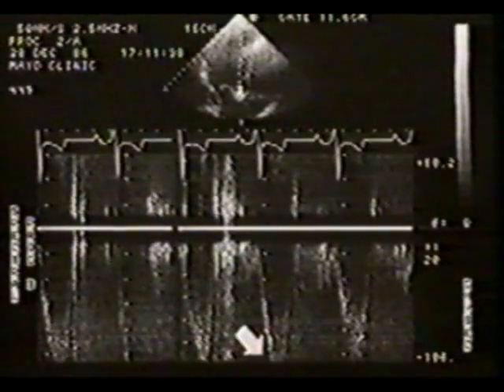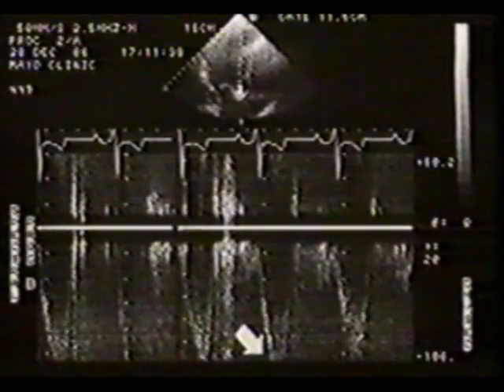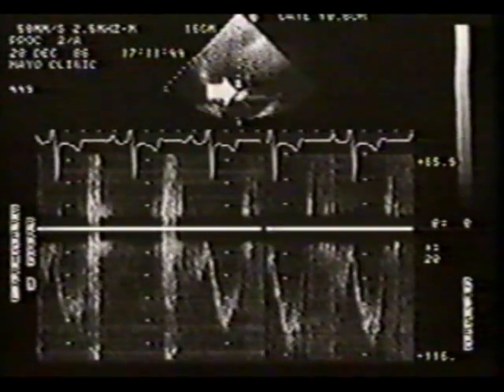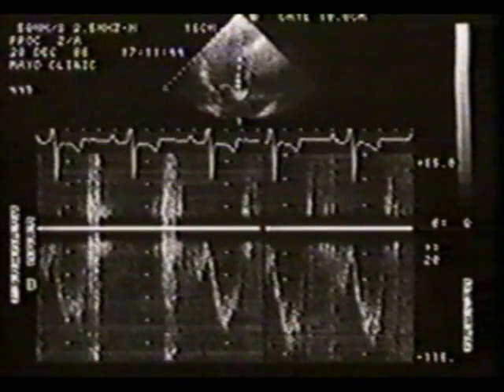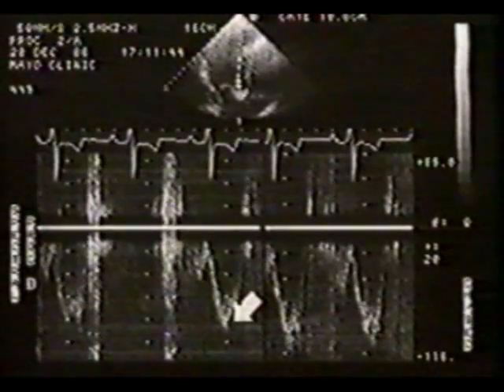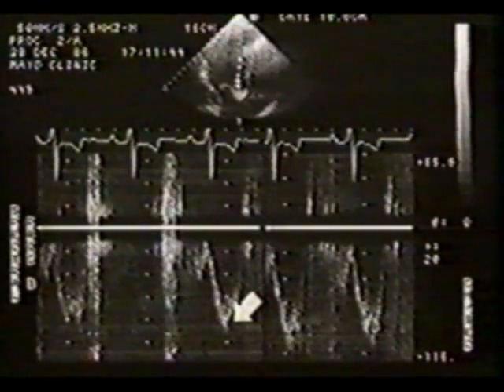This increase to 1.1 meters per second represents pre-stenosis acceleration and should not be accepted as the true LVOT velocity. We will now move the sample volume back slightly from the aortic valve. The slight motion of the sample volume away from the valve has resulted in a large decrease in velocity, from 1.1 meters per second back to 0.8 meters per second. From this, we know that 0.8 meters per second is the LVOT velocity that we should use in the valve area calculation.